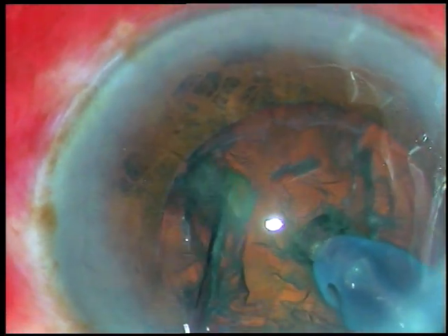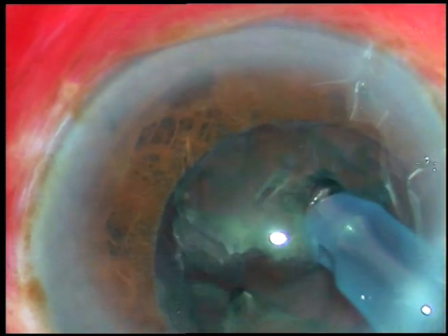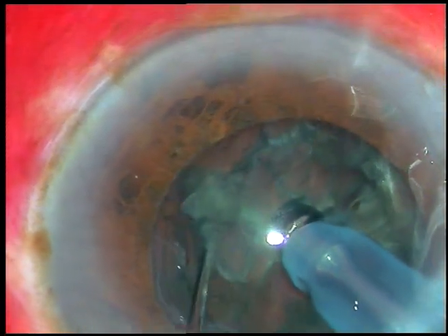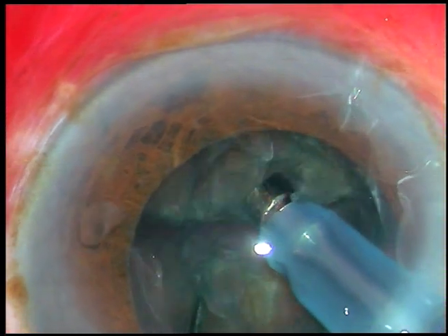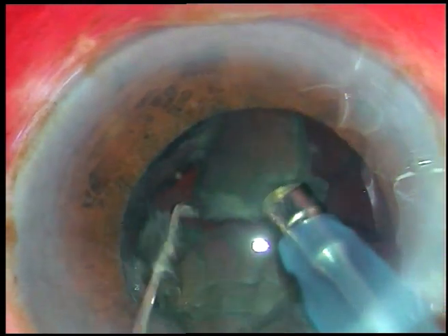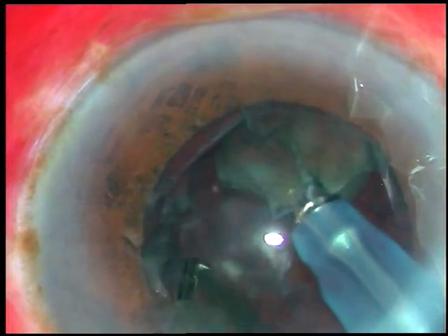So this is direct chop. I buried the tip into the substance of the nucleus and just sliced the nucleus. This nucleus is soft and if I try to hold it with a vacuum, it may not be possible. So I just support the nuclear mass with the FACO tip and with the chopper, just slice the part of the nucleus which is in front of the FACO tip, and the nucleus divides into fragments.